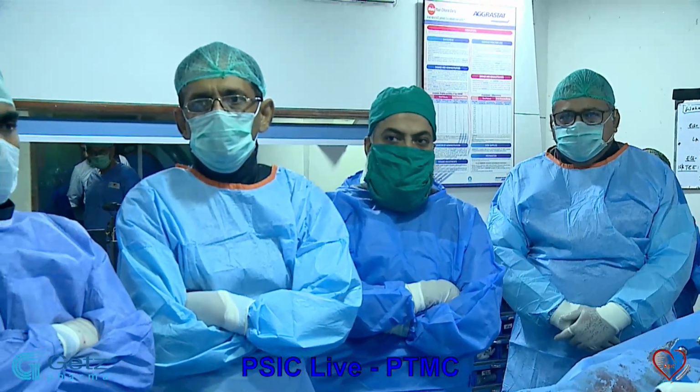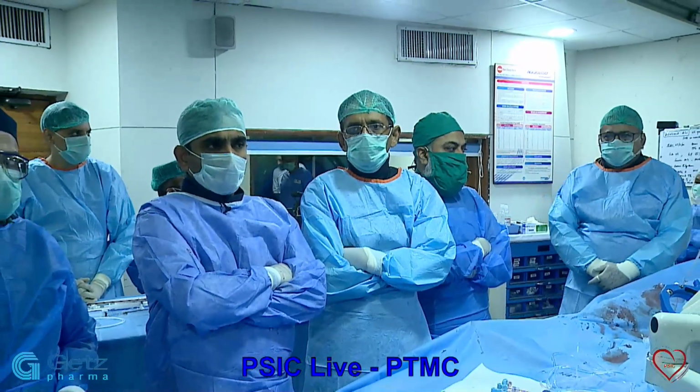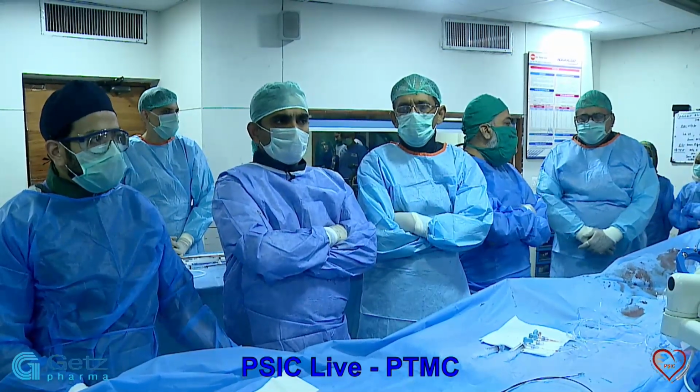We have an echo backup by our senior associate professor from the echo department, Dr. Sumaya Gormani, and his technician Samina Naz.